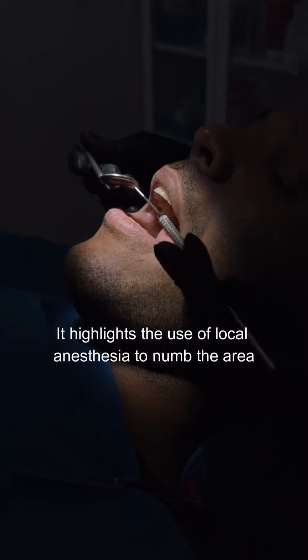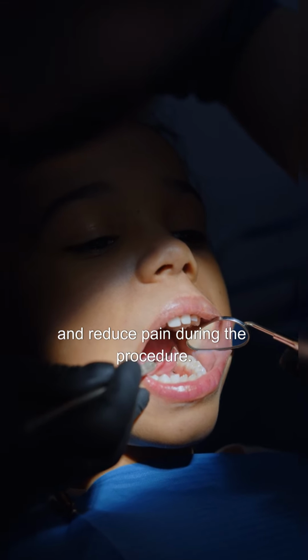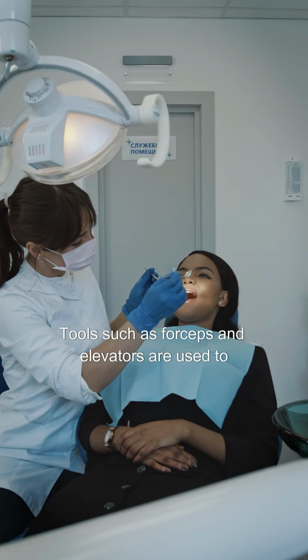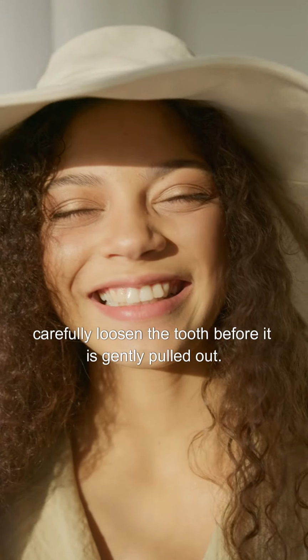It highlights the use of local anesthesia to numb the area and reduce pain during the procedure. Tools such as forceps and elevators are used to carefully loosen the tooth before it is gently pulled out.